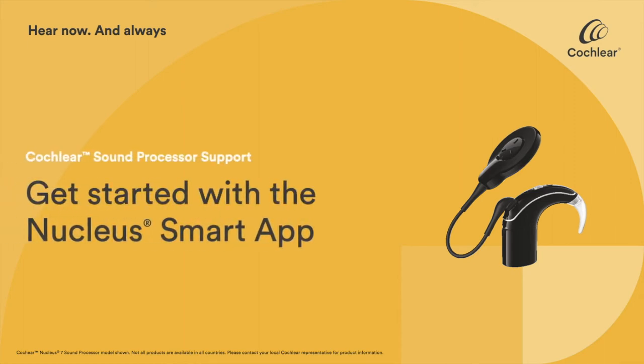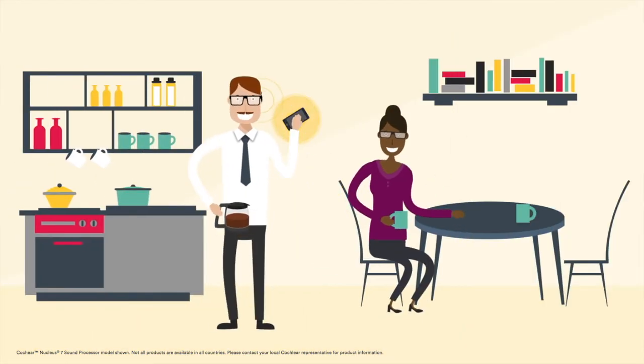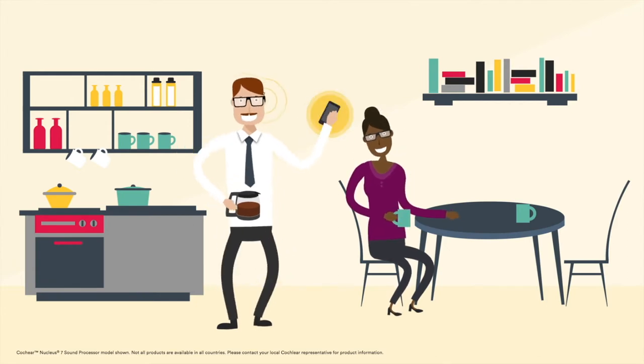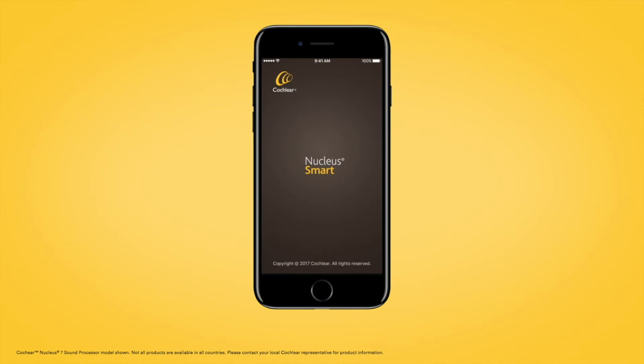Designed specifically for the Nucleus 7 sound processor, the Nucleus Smart App is the first ever mobile application to control a cochlear implant sound processor directly from a compatible Apple or Android device.